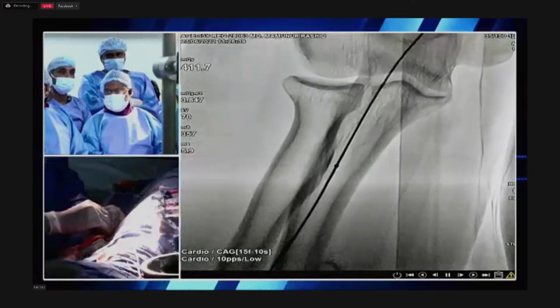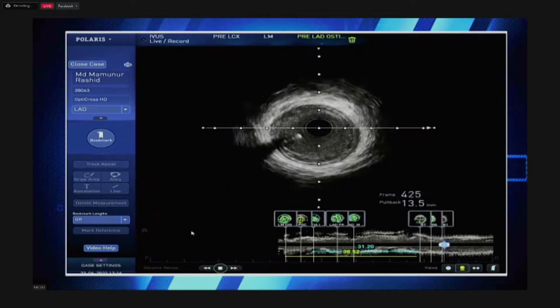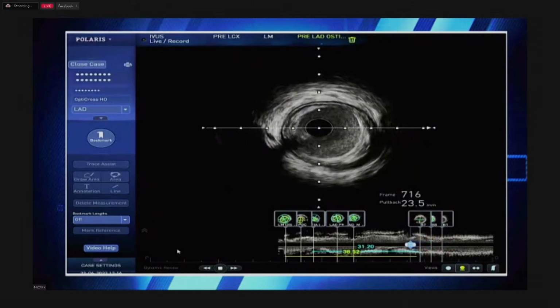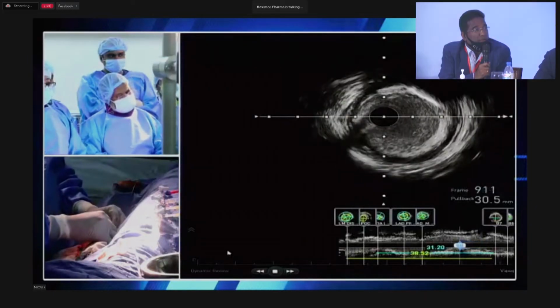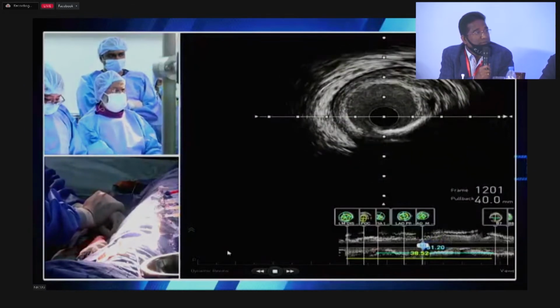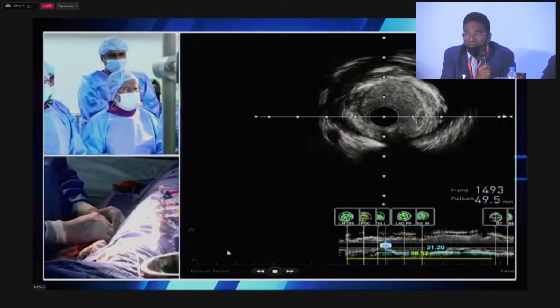Show them the IVUS findings. This is the IVUS pullback from distal LAD. Mir Jamal sir, can you hear me? Yes, we are hearing you. Sir, why do you take IVUS for imaging? Because I know in your cath lab also OCT. Ostial lesions, left main lesion, ostial lesion, it is better to image with IVUS, but we can do also OCT. Afterwards, after doing the angioplasty, we shall show the OCT run. Okay, thank you, sir.